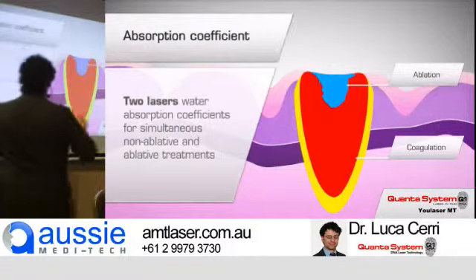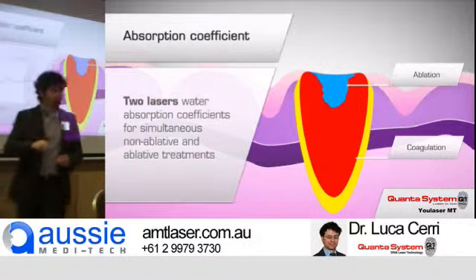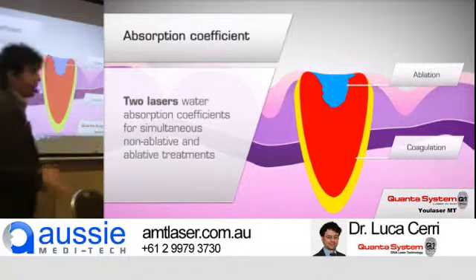With the CO2 we can have fantastic tightening effects, but going deep means very long downtimes and managing the patient for a long time.